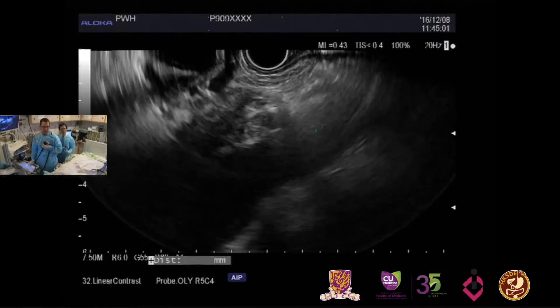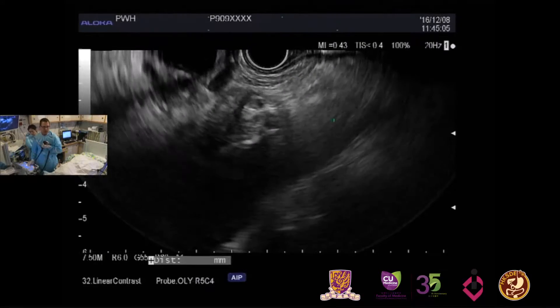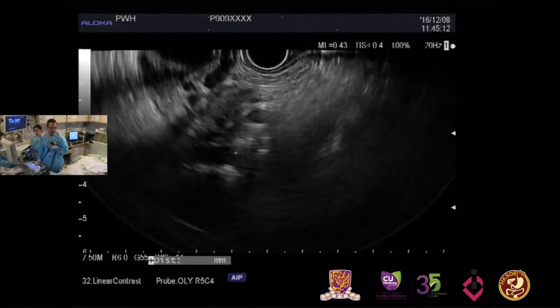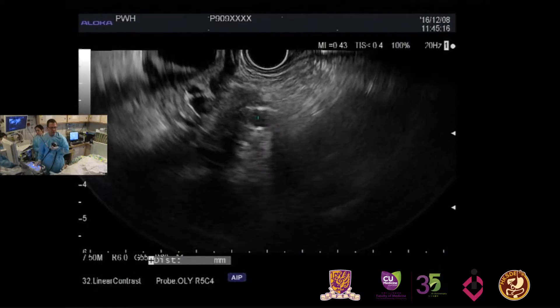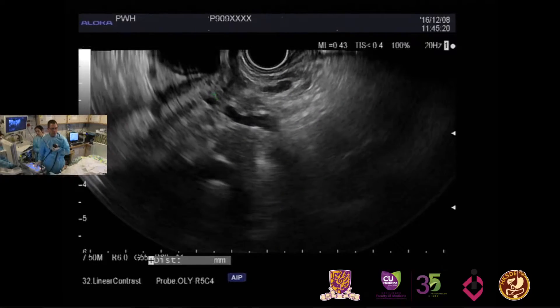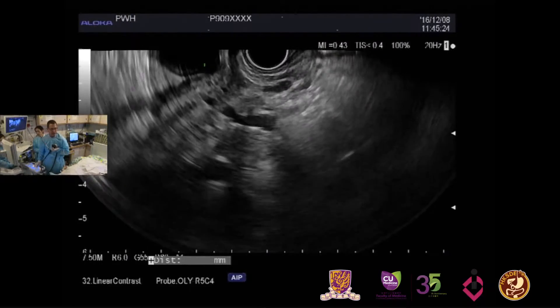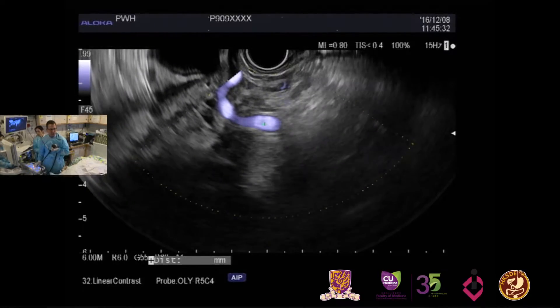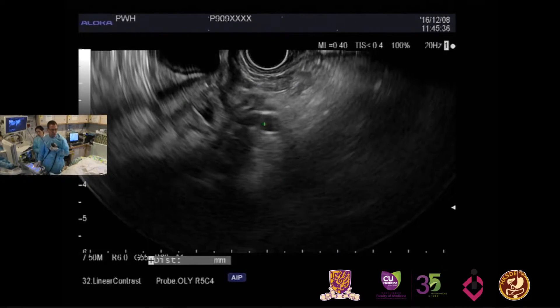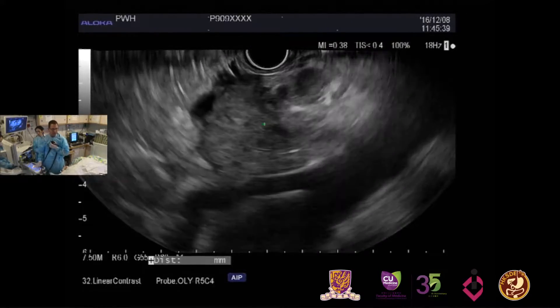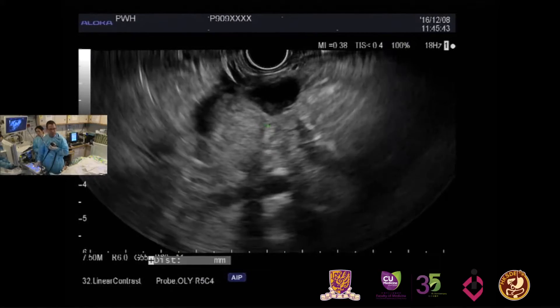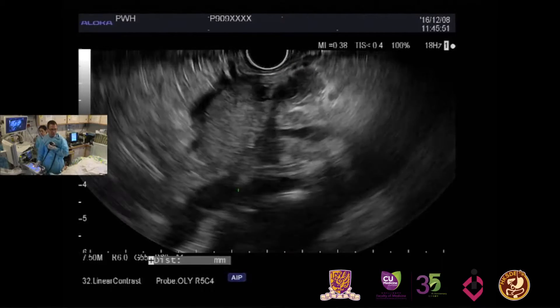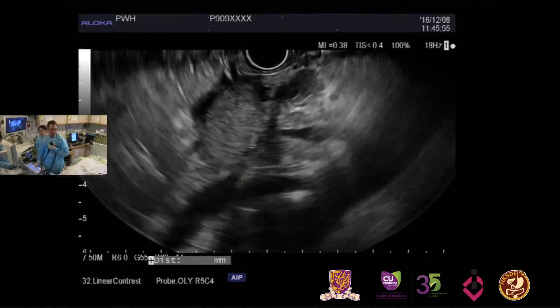Here we have the descending aorta. The feet are to the left and the head is to the right. Here is the celiac artery coming off, and the second vessel below it is the superior mesenteric artery. We can see the celiac artery entering this dark tumor, which has both a solid and a cystic component, and the celiac artery is completely encased. There is also slight involvement of the superior mesenteric artery and the superior mesenteric vein.